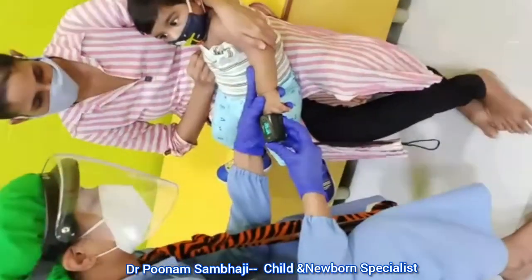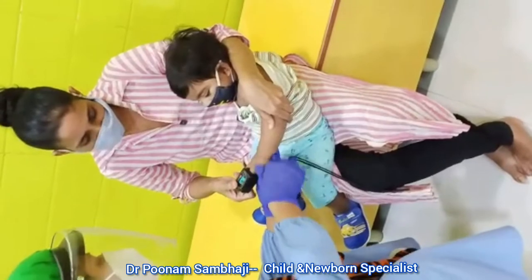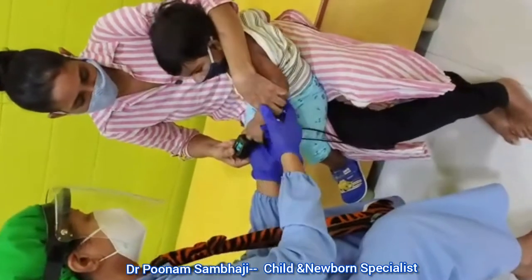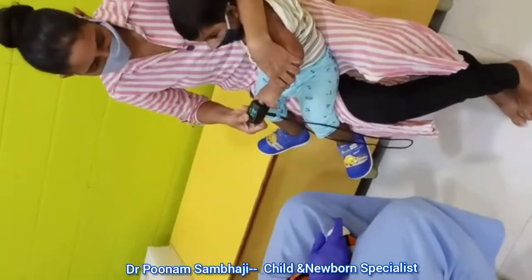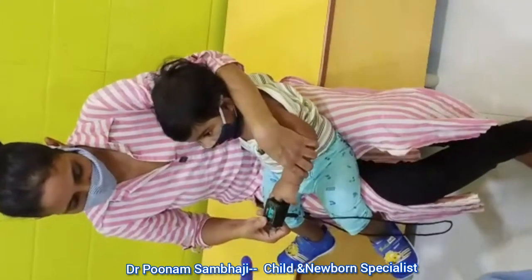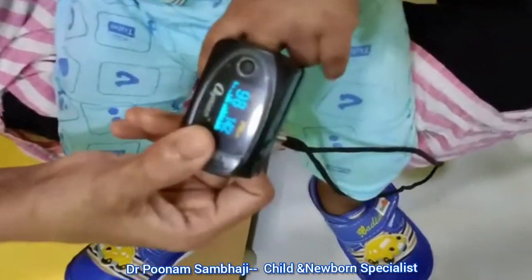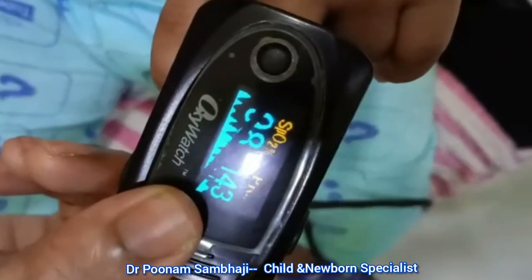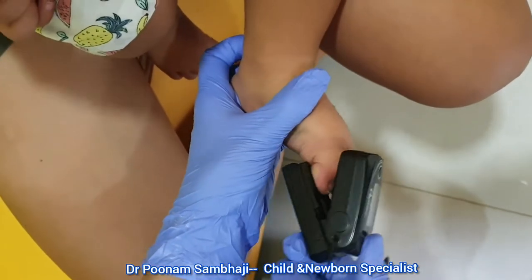Now see how cooperative this child is. The mother can very well hold the clip, that is the pulse ox, in her hand, and that string which is hanging can be put either on the baby's neck or the mother's neck, so that if by chance the pulse ox falls off, it won't fall on the ground. So you can see the number 98 is the saturation and the other one is the heart rate.